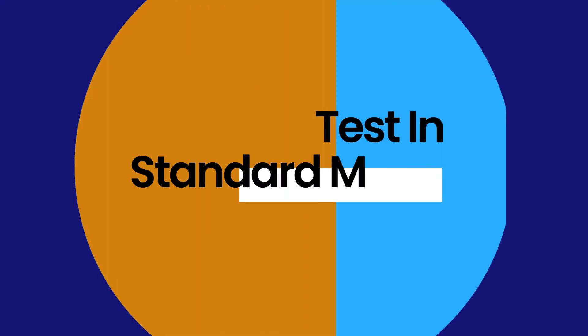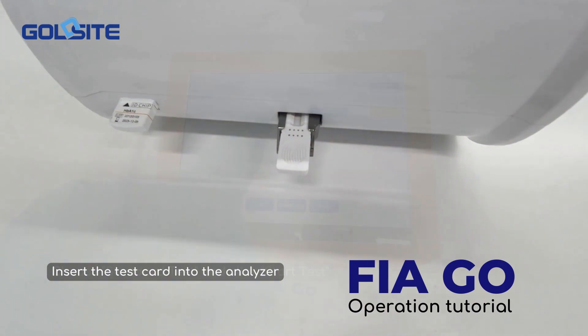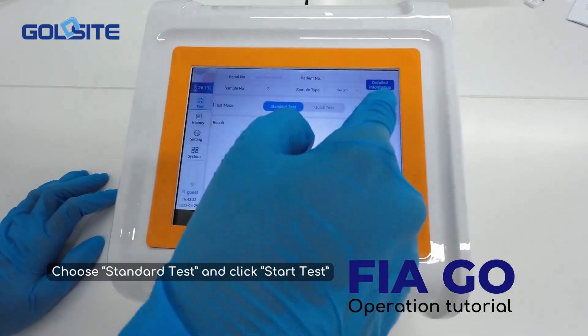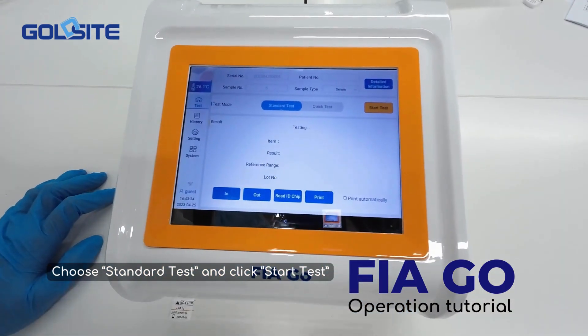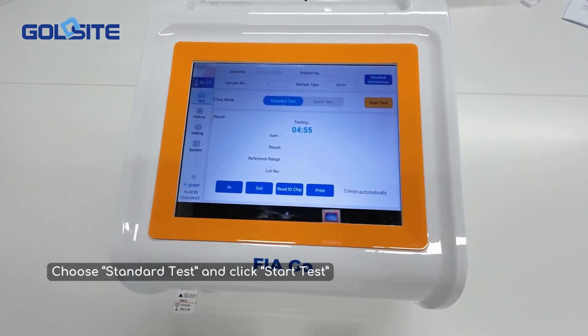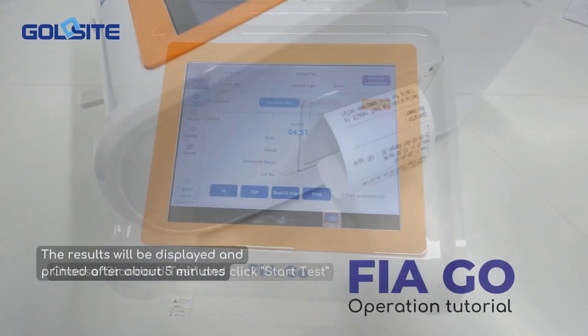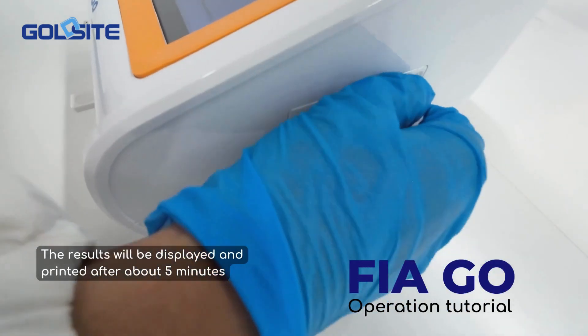Test in standard mode. Insert the test card into the analyzer, choose standard test, and click start test. The results will be displayed and printed after about 5 minutes.